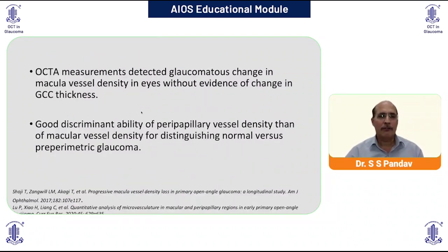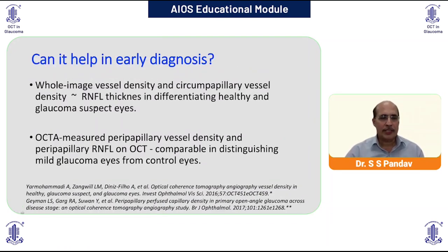There is a little bit of uncertainty in the sense of what precedes: whether the OCTA capillary dropout areas precede the retinal nerve fiber thickness changes, or whether the capillary dropout areas are secondary to the damage to the nerve fiber which has already occurred.